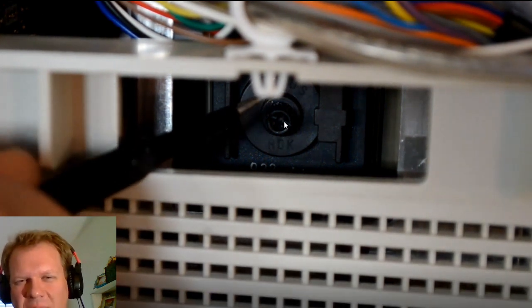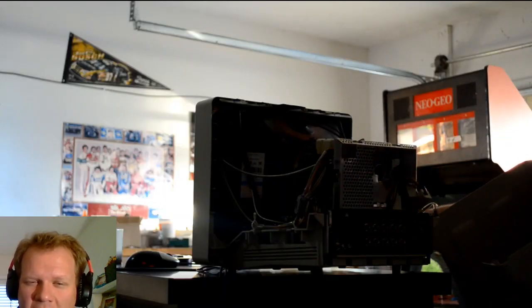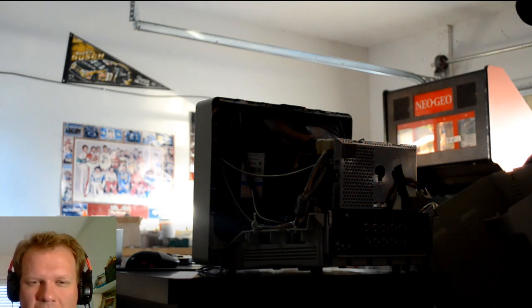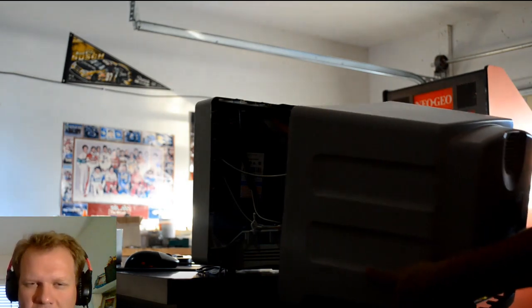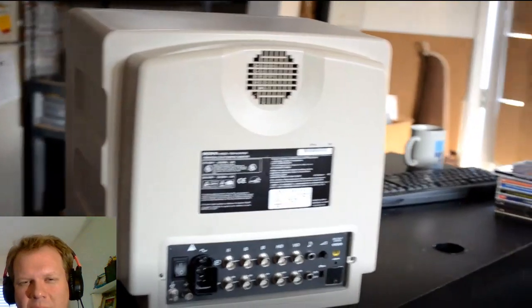But this one only has a focus knob on the back of the flyback. But it is accessible in this side vent on the side of the monitor. So you don't have to actually take that apart to access the focus knob in case you just want to make a focus adjustment, or if it comes out of focus, you could do that without actually opening the PGM completely back up. And the last thing to do was reassemble it, and that's pretty much it.